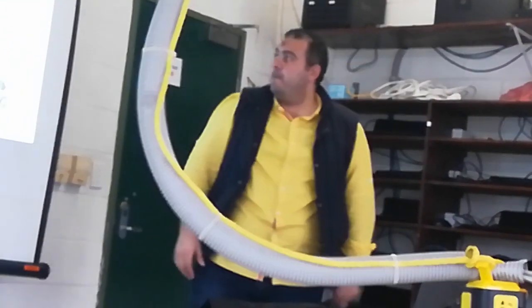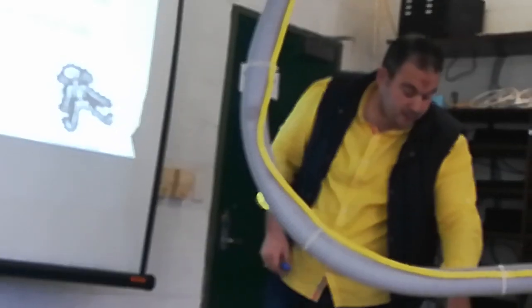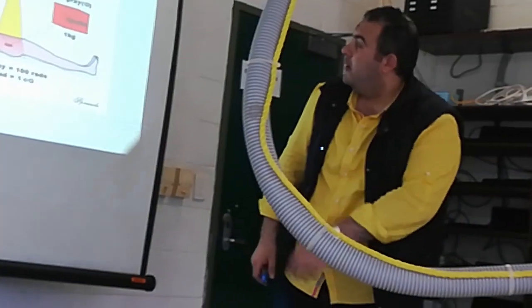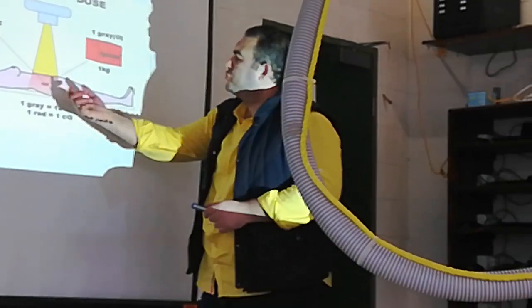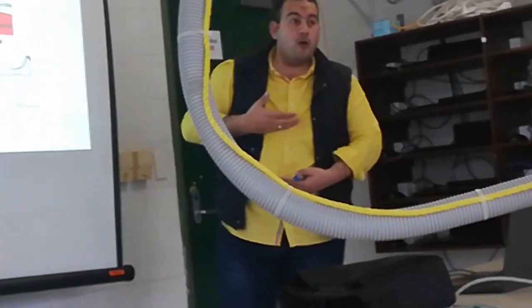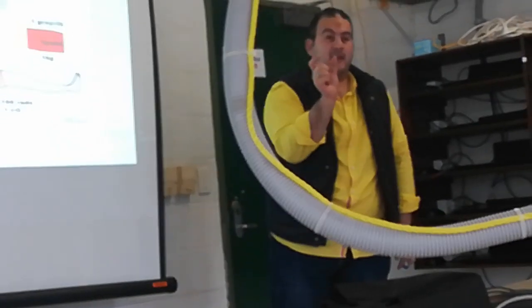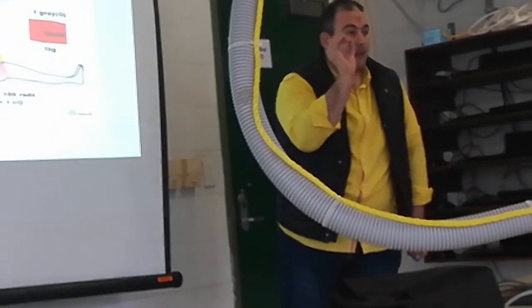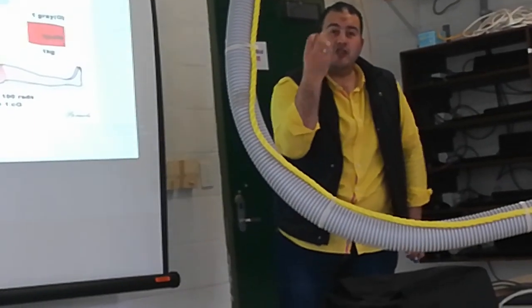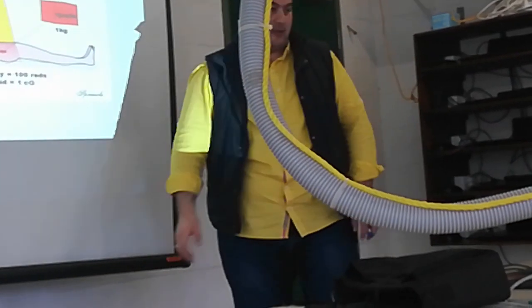The aim of CT scan is less patient absorbed dose and an optimal diagnostic image. For this X-ray tube, I want to calculate the absorbed dose of the organ or patient, so I have to know the energy loss per unit of mass. If I can calculate the energy loss per unit of mass, I can calculate the absorbed dose of the patient.